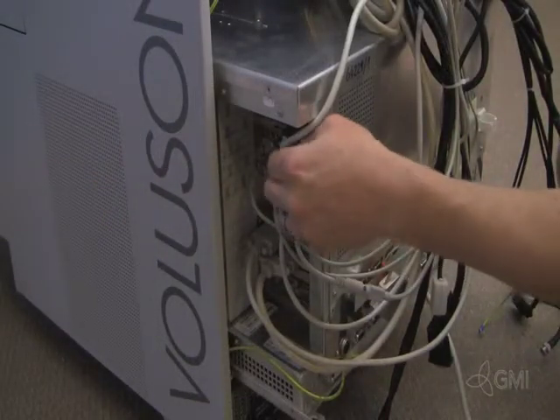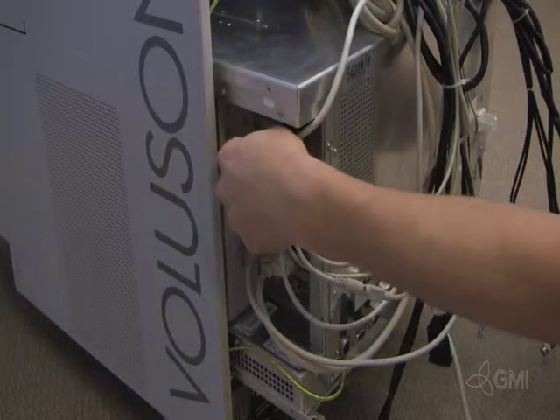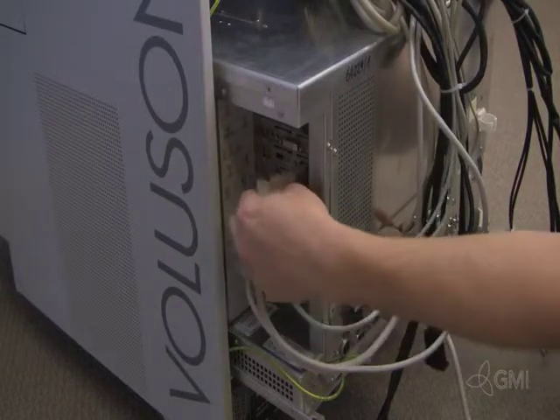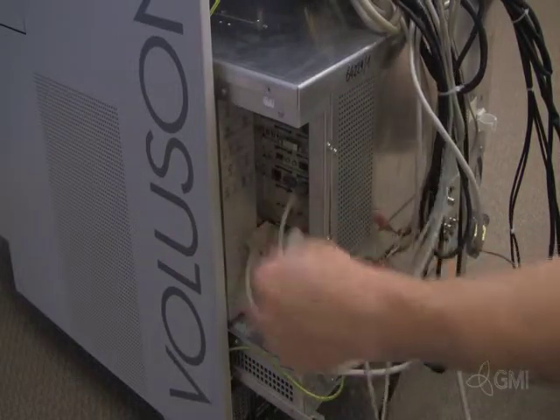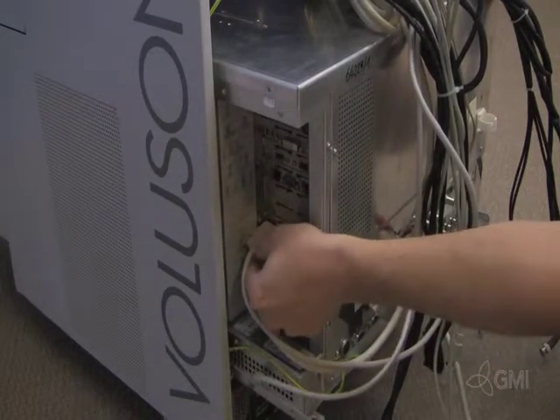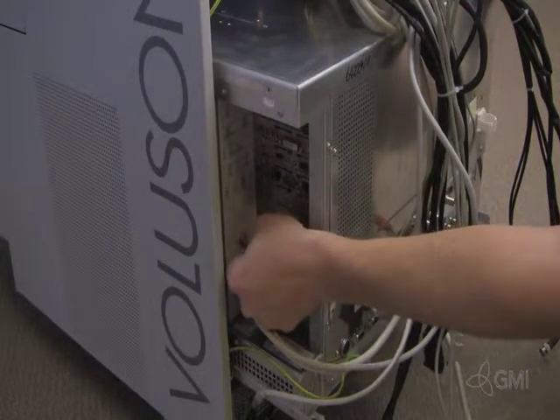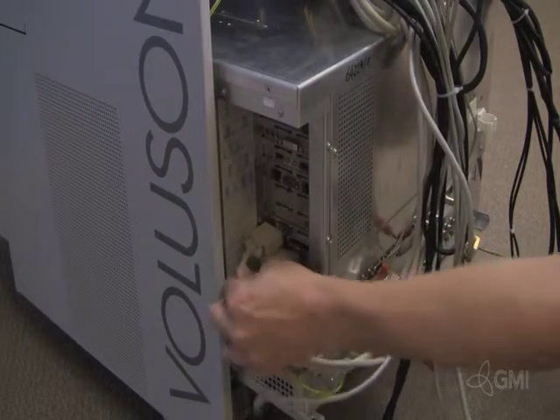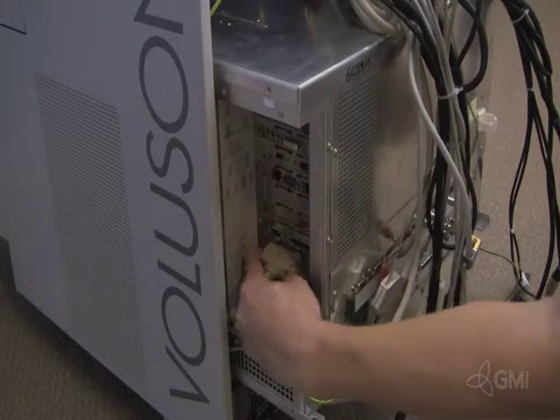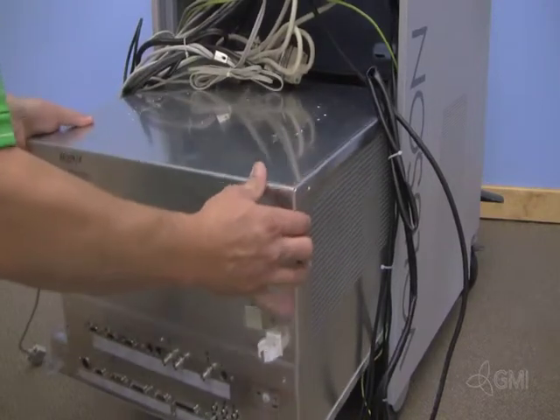Remove all cables from the BEP, noting each location. Once all cables have been removed, slide the e-box completely out.